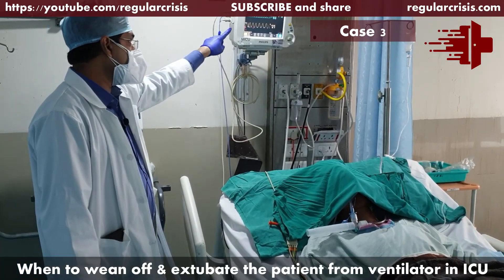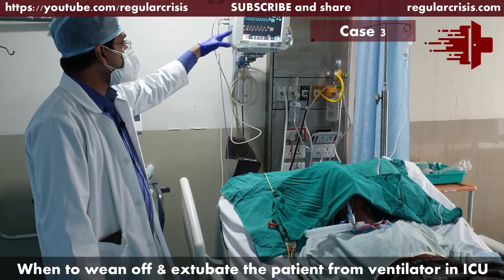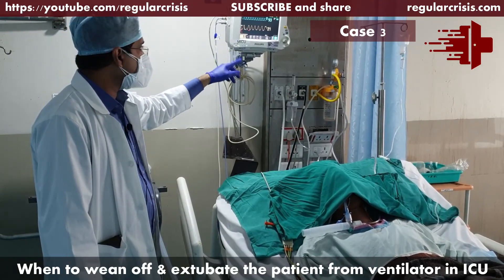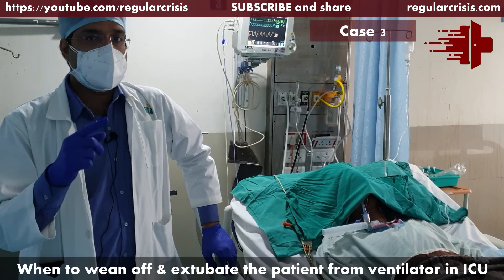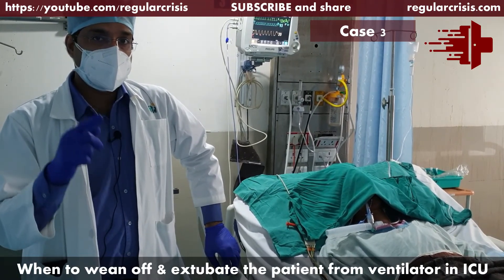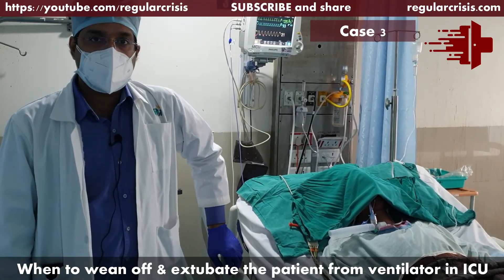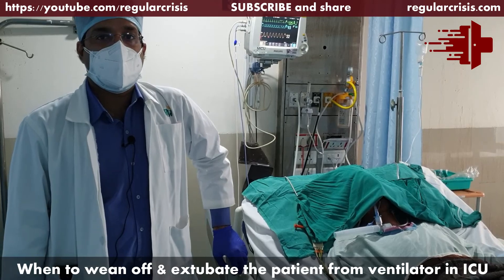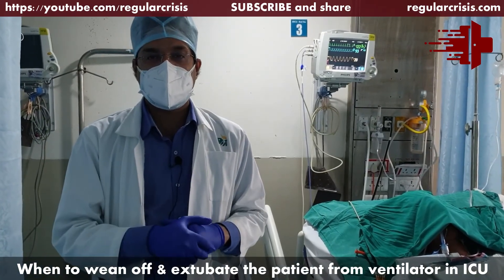Still, we have given a T-piece trial. It's been one hour of the T-piece trial. As you can see, the patient has become slightly tachycardic — heart rate is 124, saturation is 93% with 3–4 liters of oxygen which is fine, but the respiratory rate is 21. He has become slightly tachycardic and tachypneic on the T-piece trial. So this is not a good time to extubate. We will take the patient back on spontaneous mode ventilation and repeat the T-piece trial the next day.